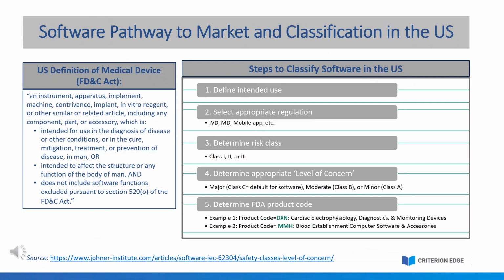In the US, medical device software follows the same classification that is used for all medical devices.